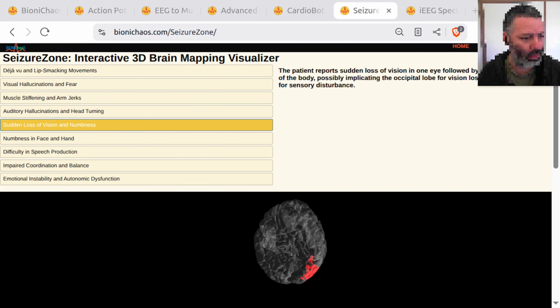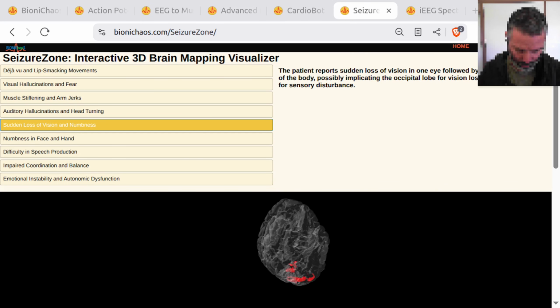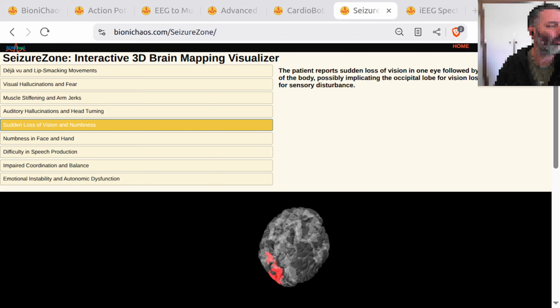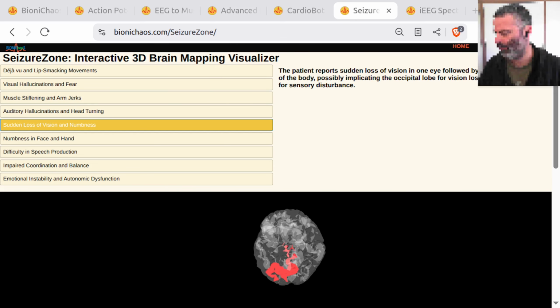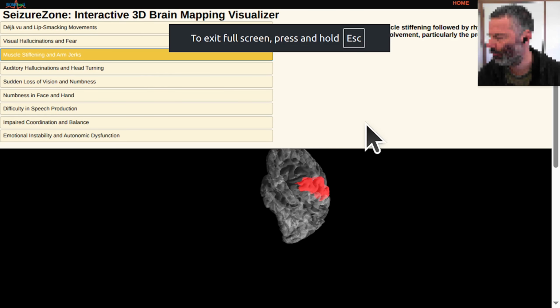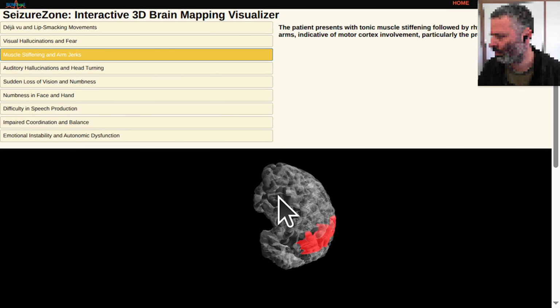Let's be forensic about these final two tools. They look similar, but they address two sides of the same clinical problem: localization and analysis. Let's dissect the anatomical model first. Dissect away. One is the where, the other is the what. Starting with the where, which is always the most complicated place to be. Tool 1. SeizureZone, the neurological locator.